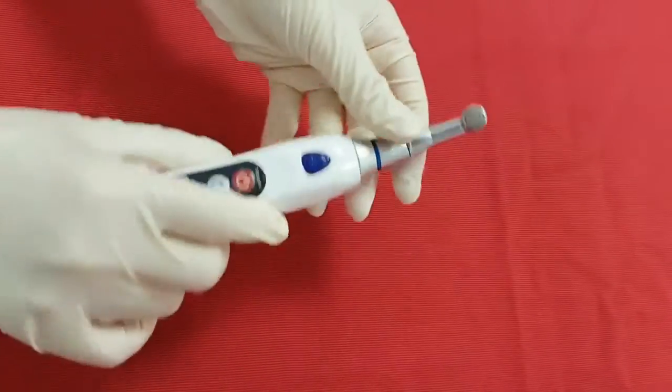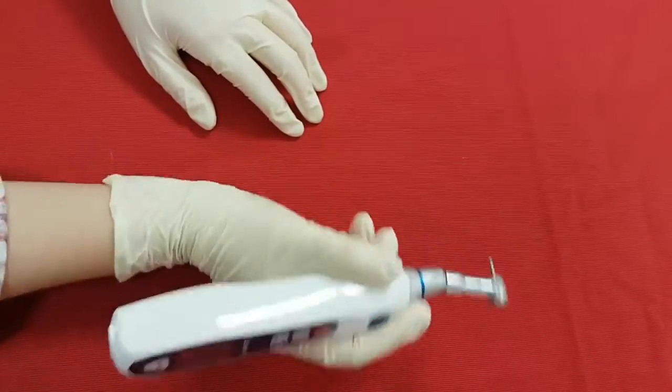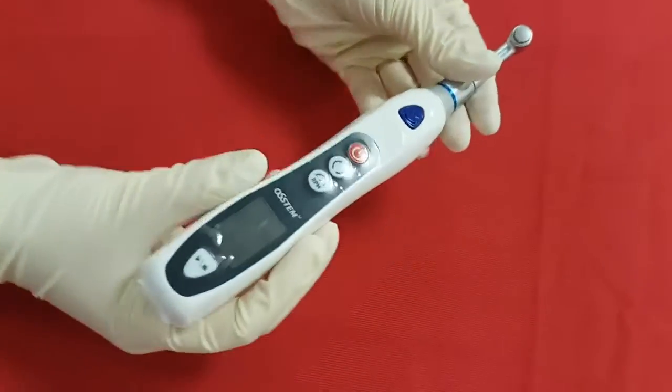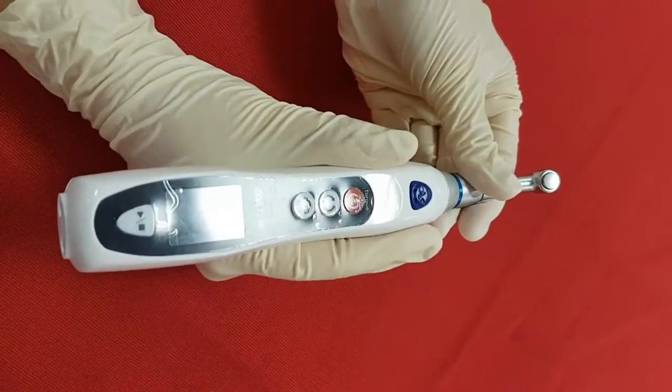When you use the eDriver, please move the body up and down or right and left only. Please do not bend or curve it. It's easy to grip since the body of eDriver is not too thick or thin.